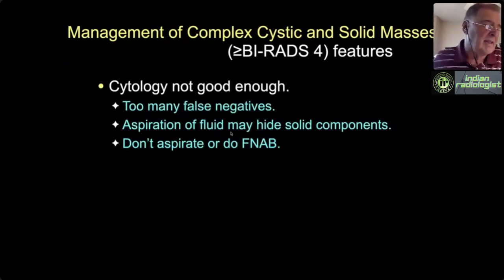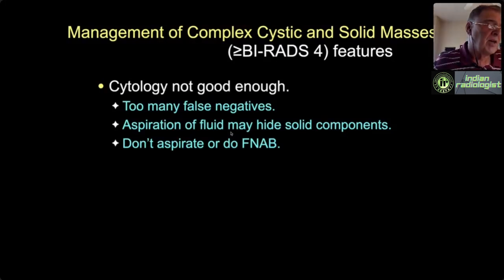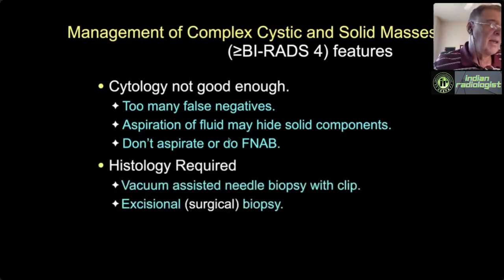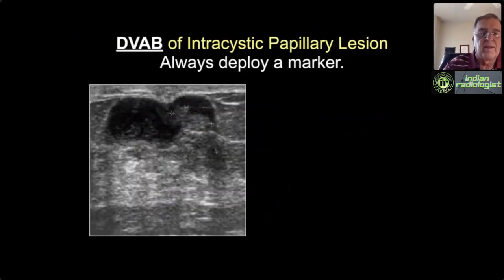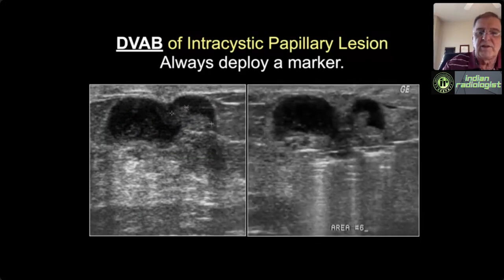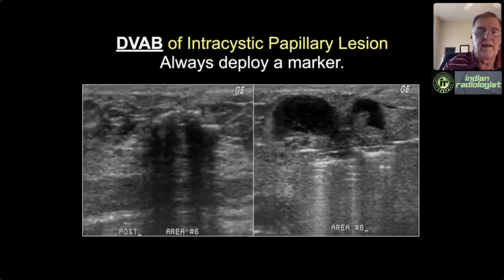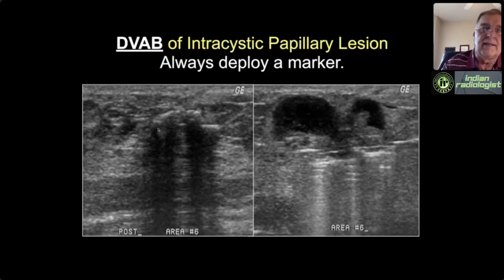Once you decide a complex cystic and solid mass is suspicious for papillary carcinoma, cyst aspiration and cytology is not the right approach. An 18-gauge or even 14-gauge core biopsy isn't ideal either. For complex cystic and solid masses, you need histology—best done with vacuum-assisted biopsy to take the whole thing out and have the pathologist serially section the entire specimen. Here's a complex cystic and solid mass we considered suspicious, with a vacuum probe. We take everything out until we get to the front wall of the cyst, then always deploy a marker in case atypia or malignancy requires re-excision.